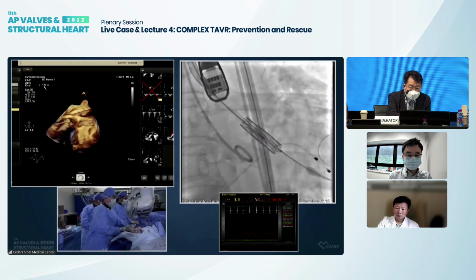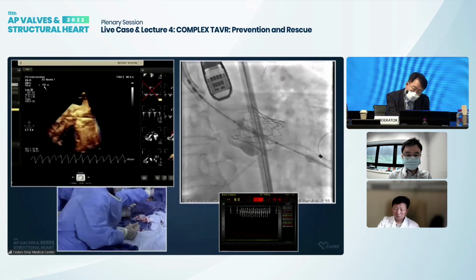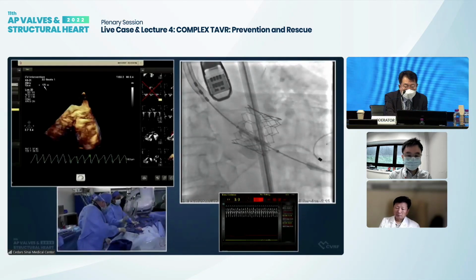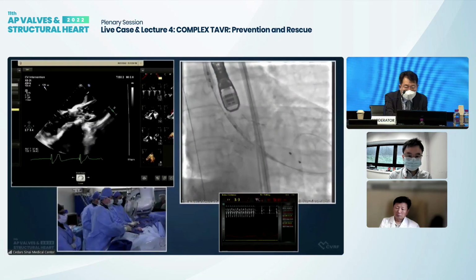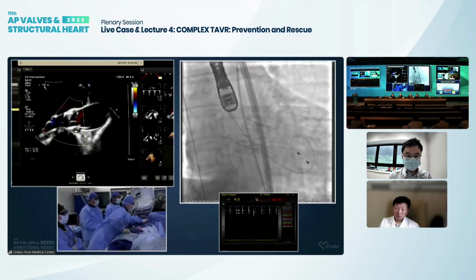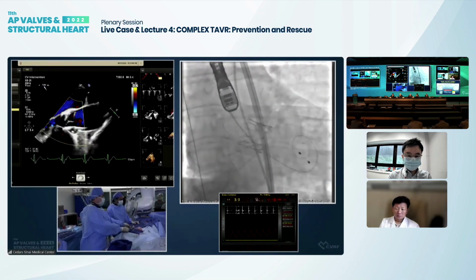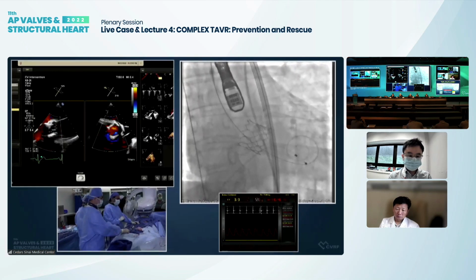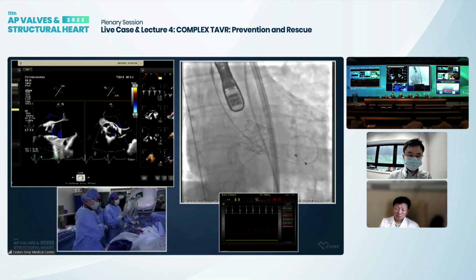Pacer on, please. Pacers on at 180 with capture. Okay, let's go up. Great. Okay, let's go 5 atmospheres down. Off, please. All right. How much volume? Minus 3. Okay, so we just want you to know that we have not given the full volume here. We have given minus 3 cc.